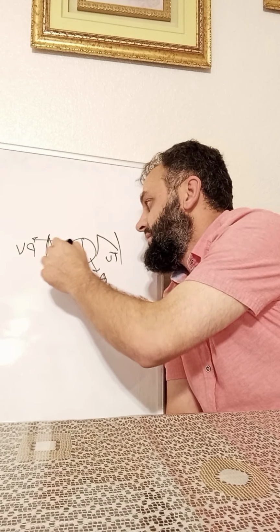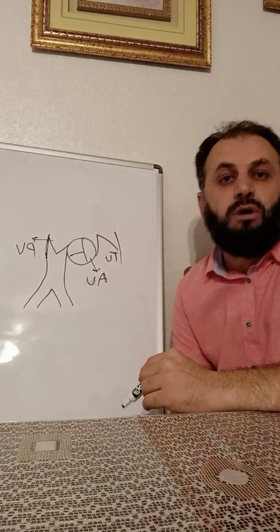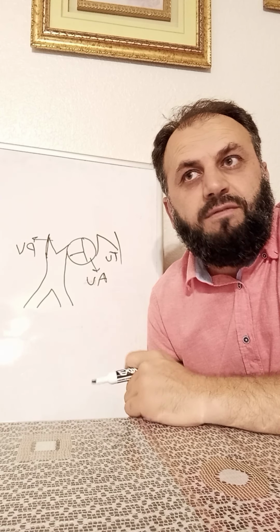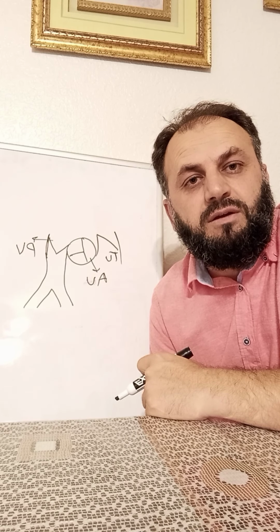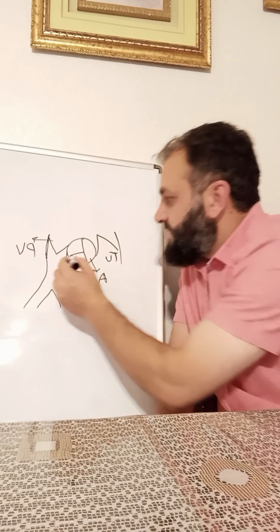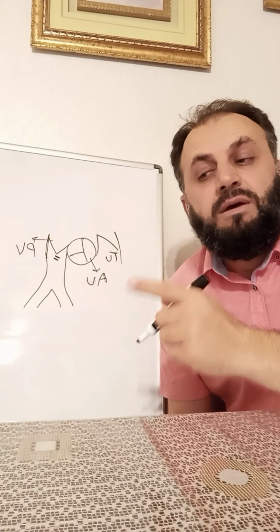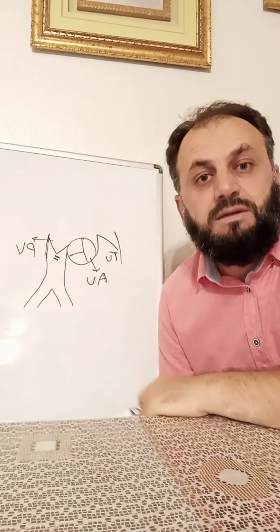Now it depends where we are looking. If we really are looking at the pulmonary valve to do measurements, or put a sample volume or gate on the pulmonary valve, so if you want to know about the valve velocity, try to put your gate or sample volume just below the valve, where the valve is opening. This information will be all regarding the pulmonary valve flow. So it can be velocity, all those things.